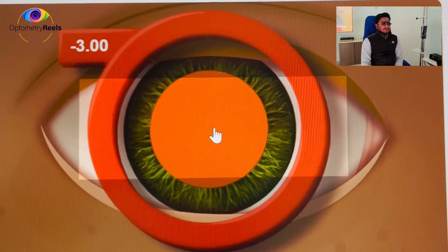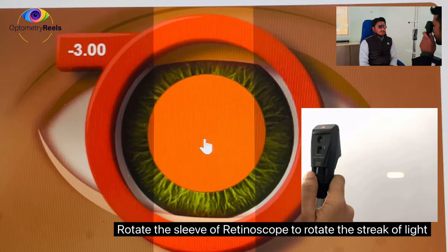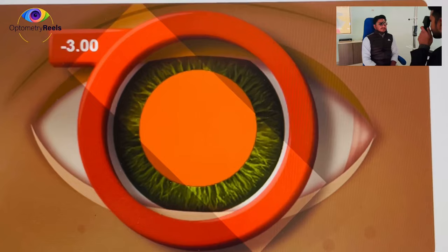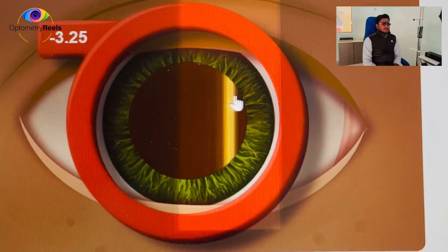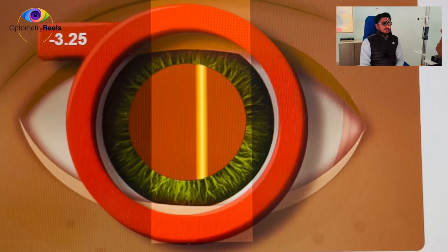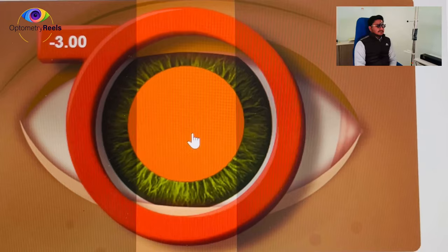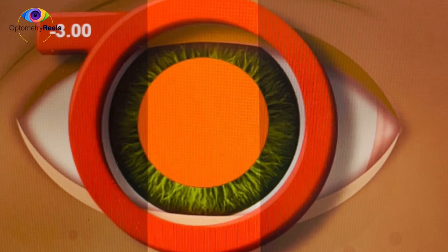With minus 3.00, this appears neutral. I'll check in all different meridians to confirm we are not missing any astigmatism — it appears neutral. Cross-checking: with minus 3.25 I can see 'with' movement, meaning we have over-corrected. Decreasing below minus 3.00 shows 'against' movement, meaning more power is needed. So minus 3.00 is confirmed as the correct neutral point.